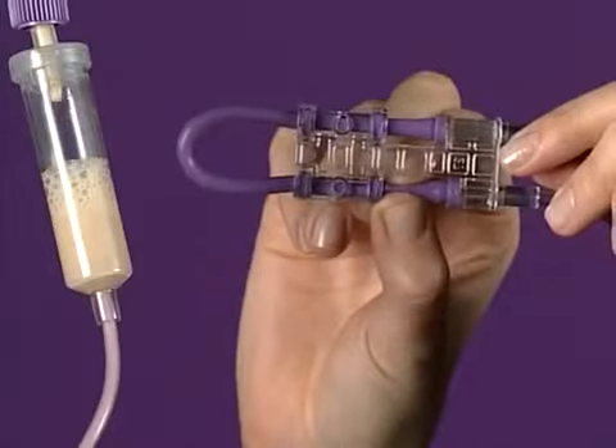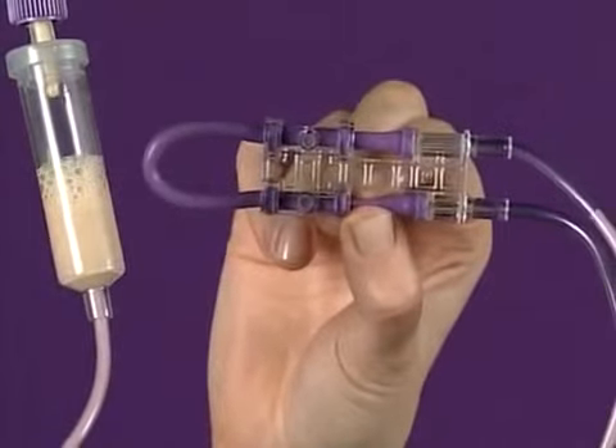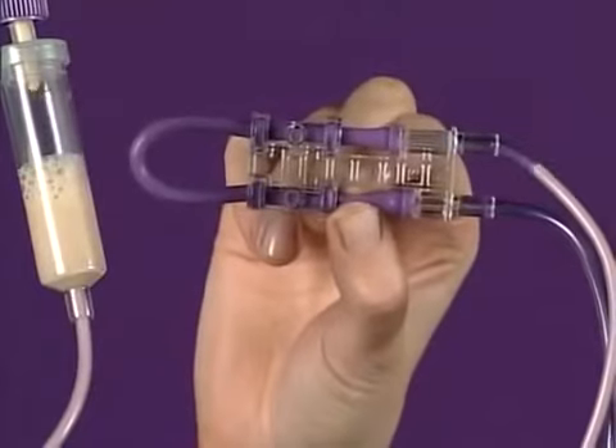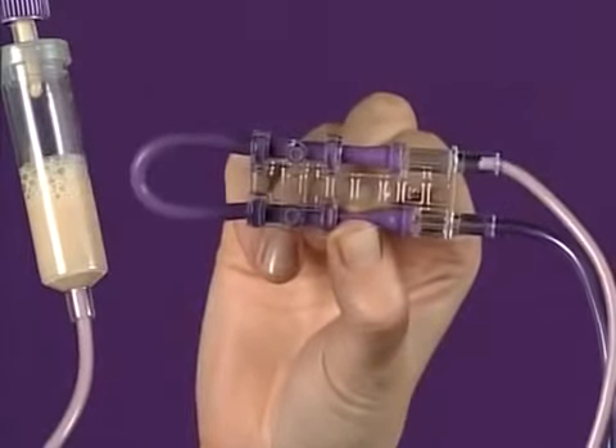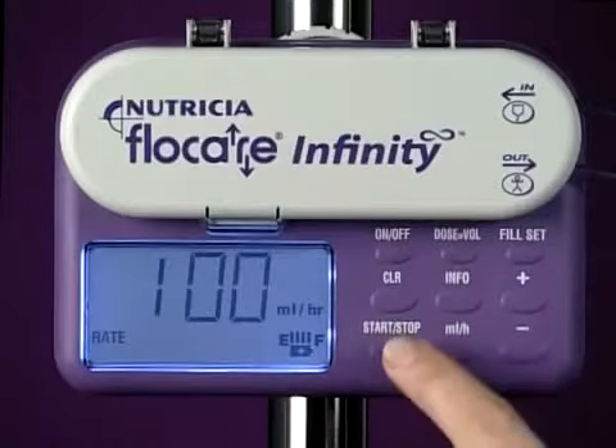Priming can also be done manually. Gently pinch both sides of the lilac tube where you see the small raised droplet symbol. Hold the tube in this position until the whole of the feeding set is filled with feed.